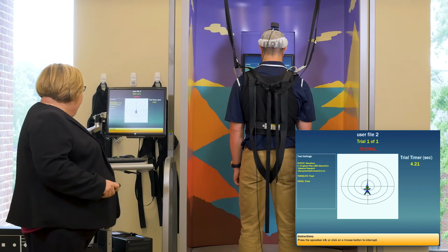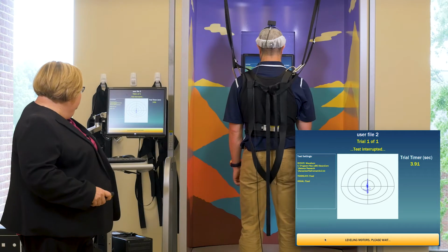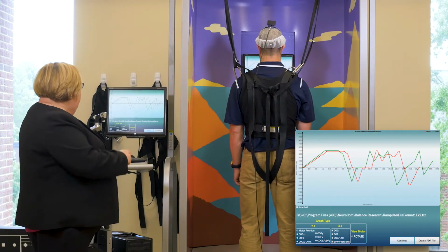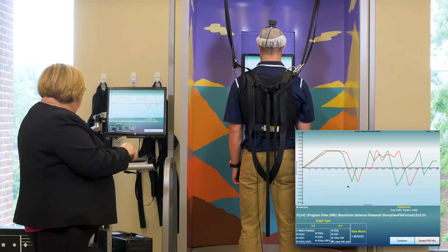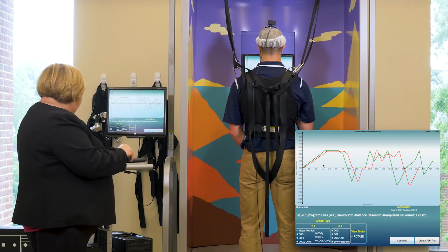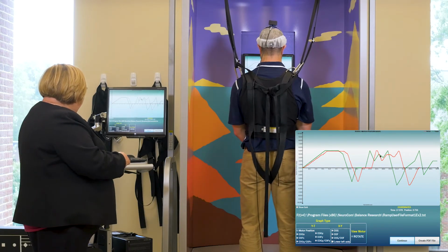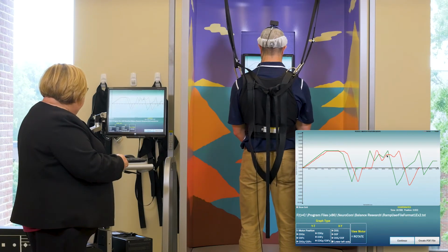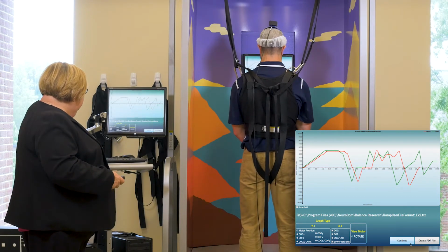And so I'm going to stop him at this point. And if we look at the motors, what we see with this is what we saw earlier, in that the position of the motors and the position of the center of gravity, they're shifted. And up here, I can get this where I want it, you can see that it maintains the velocity, though it shifted the position. But let's go back through and see what it looks like with multi-jog.